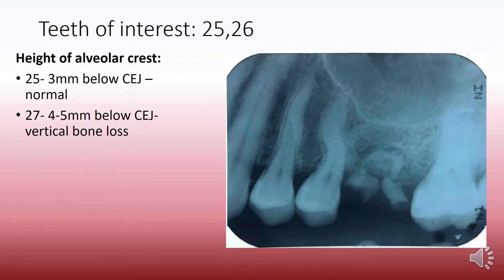Moving on to the height of alveolar crest: in case of 2-5 it appears reasonably normal, up to 3 mm below the CEJ. Whereas in case of 2-7 you can see about 4-5 mm of vertical bone loss.